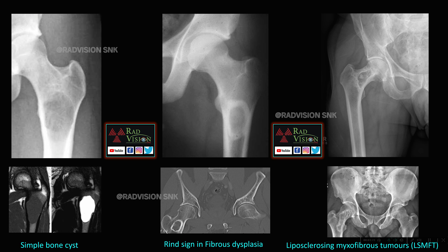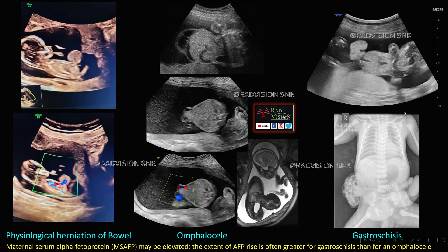Next are three different abdominal wall defects with similar imaging appearances. First is physiological herniation of the bowel, which is normal and occurs up to 12 weeks — by 12 to 13 weeks the bowel completely returns into the abdominal cavity. If there is herniation of the bowel beyond 13 weeks, definitely suspect pathology.